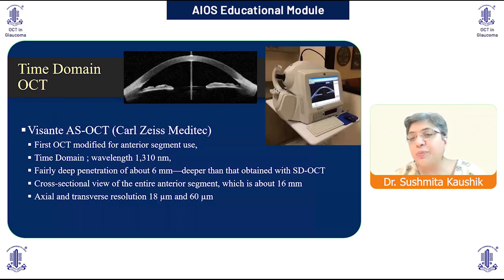So let's look at what we had. This is the Visante time domain OCT. It's not available anymore. It was the first OCT modified for anterior segment use, with a wavelength, as we've said, of 1310 nanometers. Fairly deep penetration.